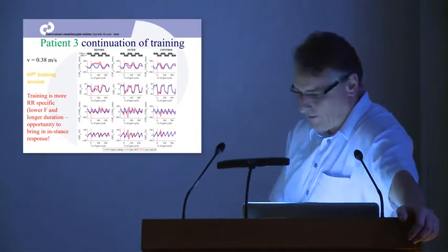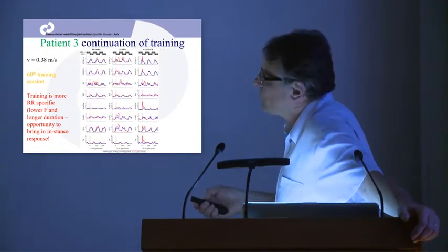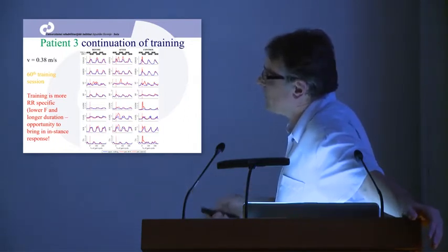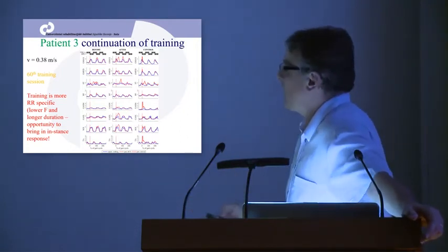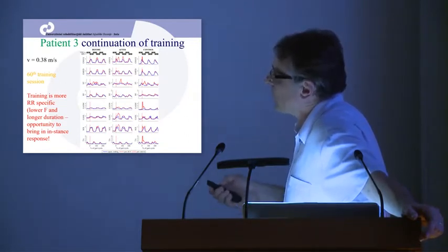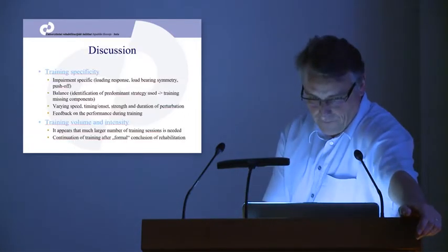And if we look at the EMGs, before I mentioned that there was no modulation of the activities of gluteus maximus and gluteus medius, while after the training, we clearly measured that there is activity in these muscles, which underlies the biomechanical effects shown on the previous slides. And these responses are quite similar to the responses of the healthy control subject.